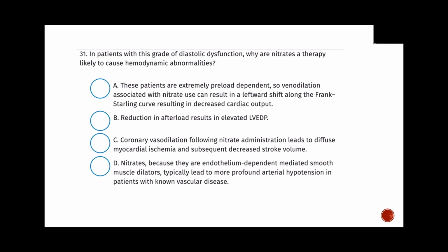If you understand your pulmonary vein physiology, that's going to also allow you to understand your hepatic vein flow later, because they work very similarly. So go through this lecture a couple times, but just try to simplify it as much as possible, and have a lot of respect for diastolic dysfunction when you're taking care of patients with cardiac disease who have hemodynamic instability, because diastology plays a lot more than we actually think prior to looking at our echocardiographic data. Any questions for anybody?